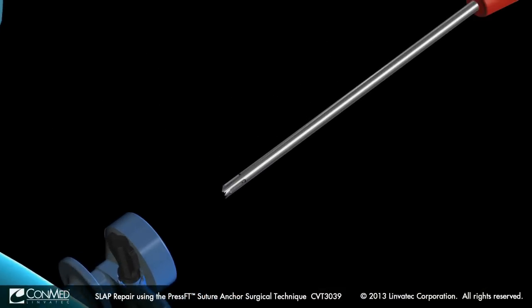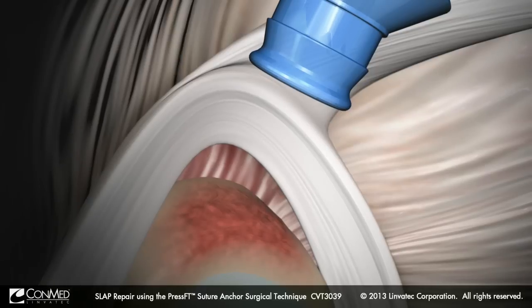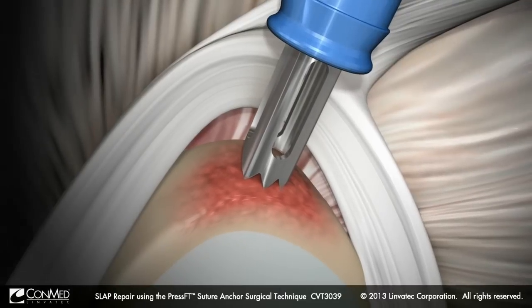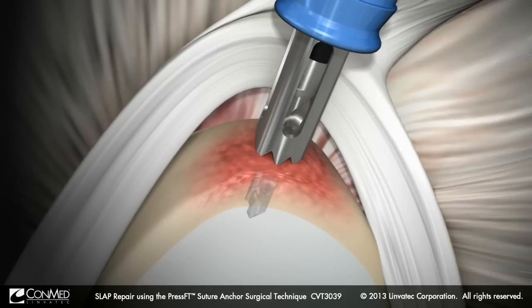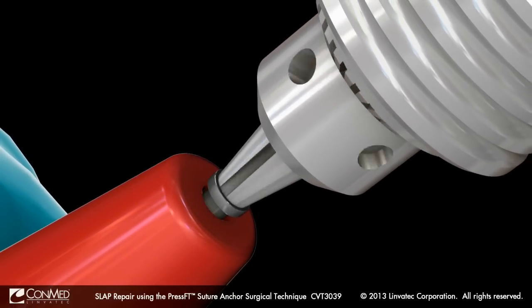Insert the instability drill guide through the anterior superior portal and into the joint. Position the guide superior to the articular cartilage just under the center point of the biceps attachment. Drill a pilot hole using the appropriately sized PressFT drill bit, stopping when the distal depth mark sits below the bone surface and the proximal depth stop makes contact with the drill guide.